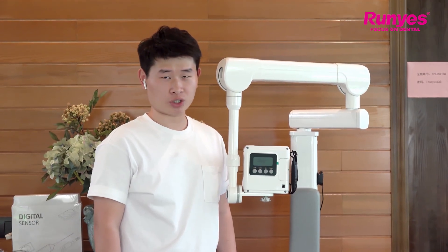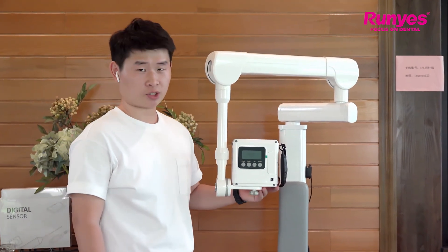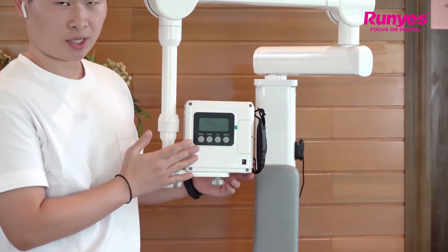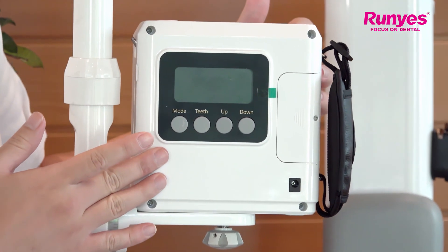Hi everyone. In this video I will show you how to operate and all the functions of our portable x-ray. So here let's take a look at our portable x-ray. In the front is the display with four function keys, and on the top is the power switch button, and on the right hand is the exposure button.